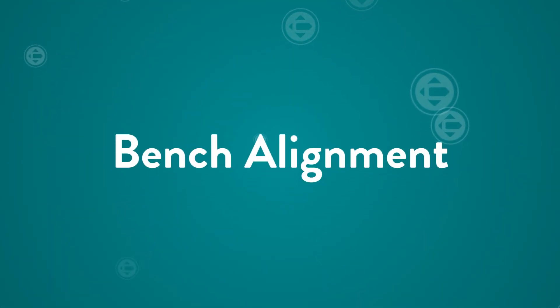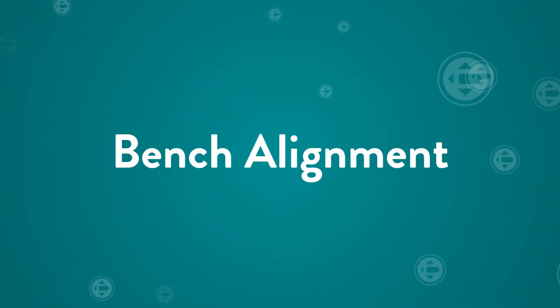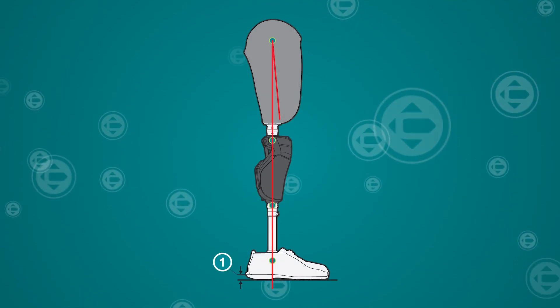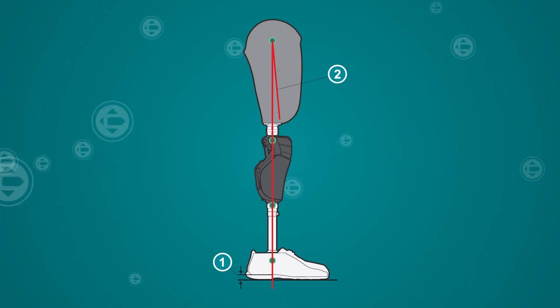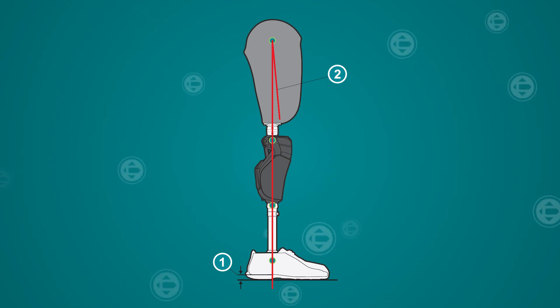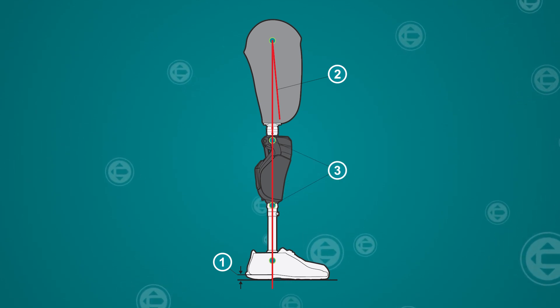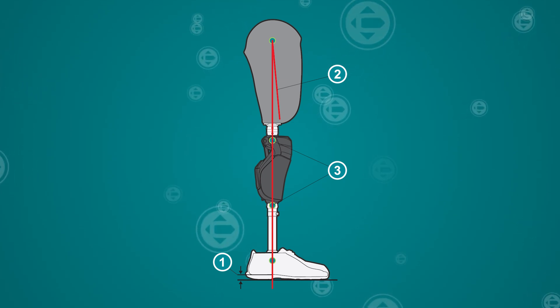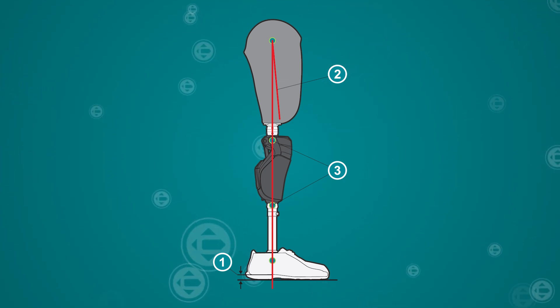To begin, let's review the recommendations for bench alignment. First, determine the appropriate heel height, then determine the appropriate amount of socket flexion. The alignment reference line bisects through the knee center, the midpoint of the distal pyramid, and one-third heel to two-thirds toe lever of the foot.